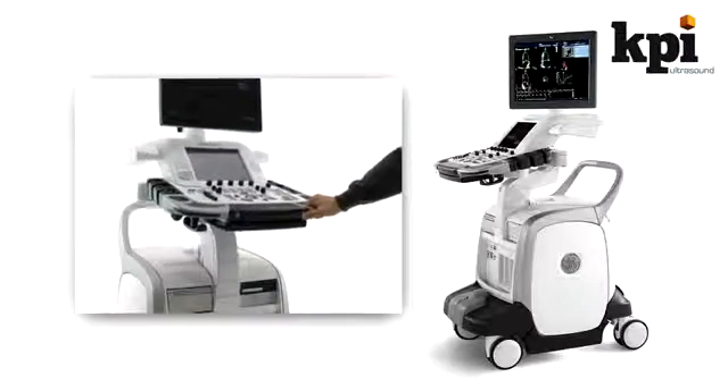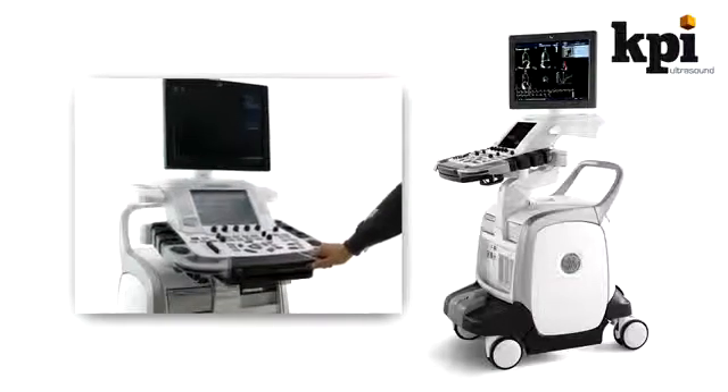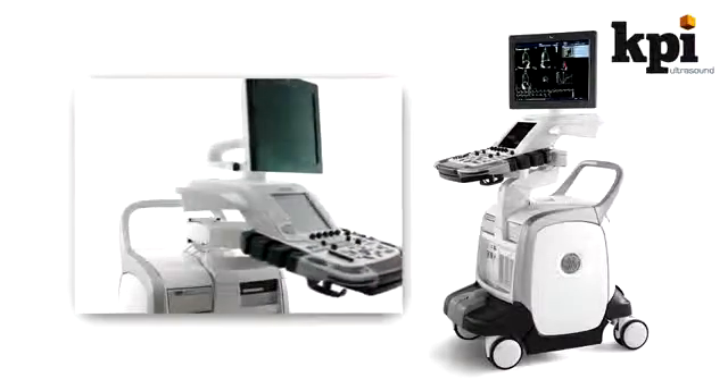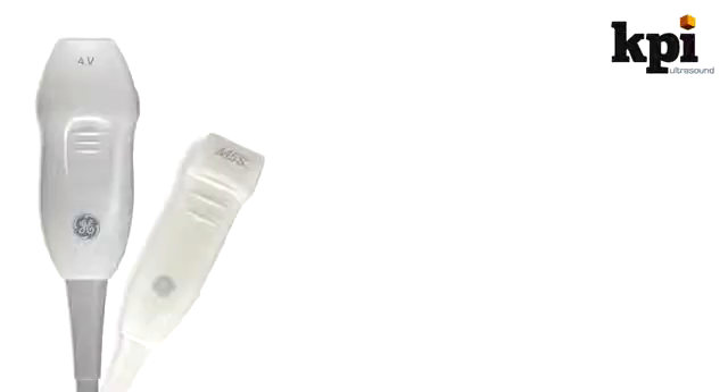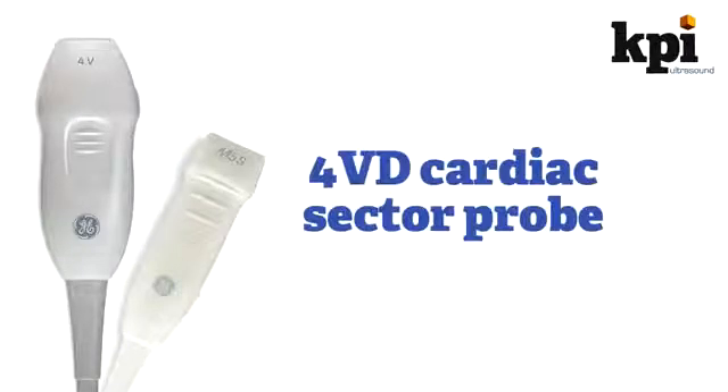The E9, like most of the latest GE ultrasound systems, has a very reliable service record and makes for easy maintenance. The E9 is compatible with an amazing 6 different TEE probes, including 2 that are pediatric. The 4D cardiac sector probe offers 4D cardiac scans in a smaller package and with higher resolution than previous-generation GE 4D cardiac probes.